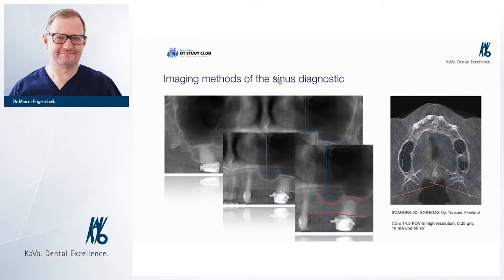Well, if you do the X-ray, it doesn't matter which kind of X-ray you do at the beginning, what can we see? What can we expect to see? Well, there are, of course, bony structures. We see hyperdense reaction, swelling or growth of volume of bone. We see lytic reaction, meaning the bone is shrinking, or we see some mixed reaction of the bone. It depends on what happened to the bone at the region where you want to perform your sinus lift.